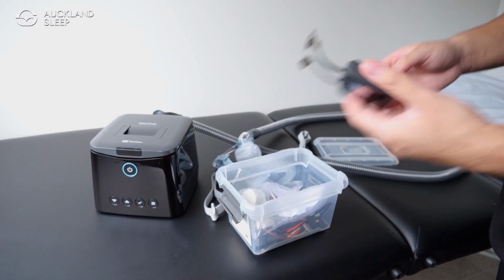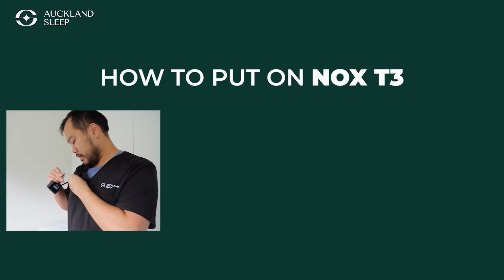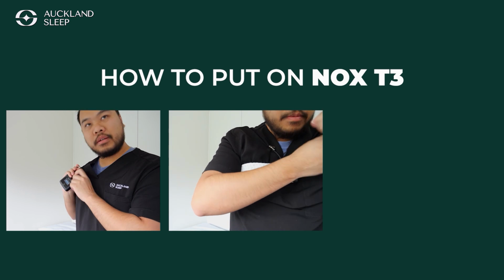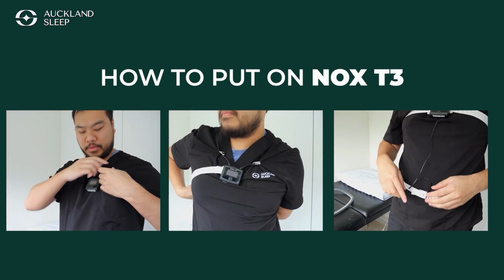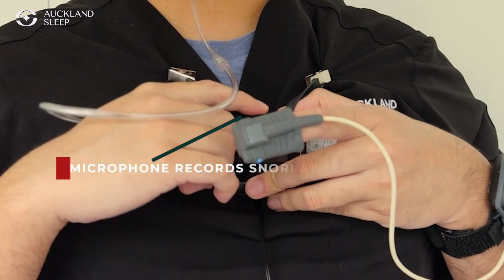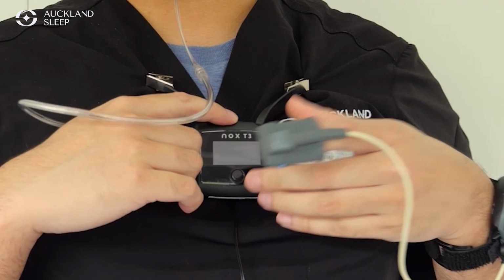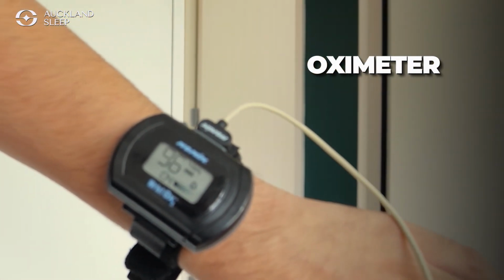Okay, so this here is the device which we use for level 3 sleep studies or respiratory-based sleep studies. So when the patient comes in, we show them how to put the device on. This will measure your breathing, respiratory effort, position. This will measure your oximetry. So this is nasal airflow, so it's measuring flow, so we know if there's sleep apnea there's reduced flow or there's absence of flow. Little microphone at the top, so it detects your snoring. There's an oximeter, so it measures your oxygen level and heart rate. Mine's nice and high at the moment.